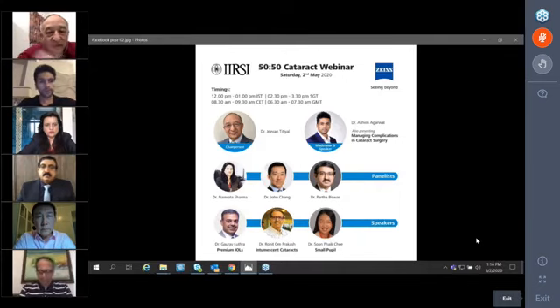Dr. Jeevan? Yes, Ashwin, I'd just like to add one thing. Recently, I reviewed a very interesting procedure for cases where you have early phimosis happening, and the surgeon had taken this patient for a femtosecond laser recapsulotomy to enlarge the capsulotomy to almost 5.5 millimeter, taking out the piece. I found that very interesting, and they showed that there was no significant fibrosis. So you have to pick up cases a little early, which Dr. Gaurav is saying, and you can do this procedure. Very interesting one.